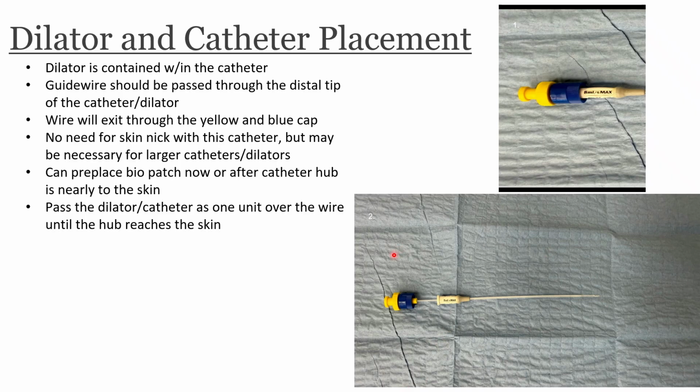So then we grab our catheter and stiffening stylet / dilator product, at least in this non-trimmable device. If you notice the two pictures, this is how it would come out of the bag. You still have this end cap threaded over the hub of the catheter, but whenever you get ready to remove everything, remember you have to unthread it.